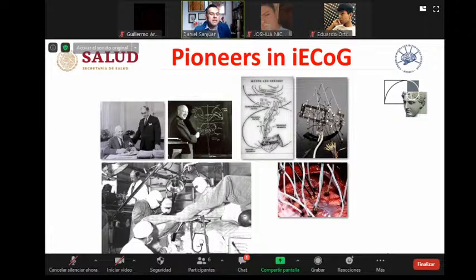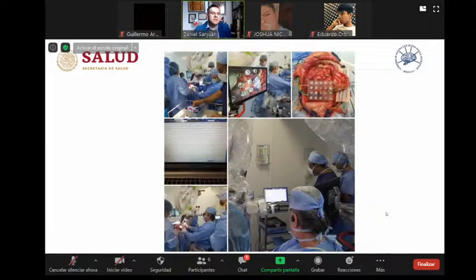And now we're sharing this kind of electrodes. This is a different stereotactic montage using these electrodes applied directly to the cortex. But now in America we use grids, subdural electrodes, or strips, or a combination.